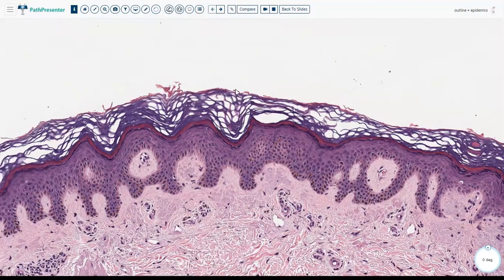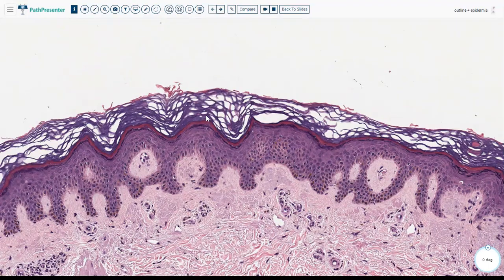What we have on top is what you already know — the stratum corneum. Normally, it has a basket weave pattern and usually covers about a quarter of the total thickness of the epidermis. You rarely find it thinned, but very often in certain pathologies it might be thickened, which we'll talk about later. Below the stratum corneum, you've got your granular layer, the stratum granulosum. It's usually very thin — not more than two or three cell layers thick.